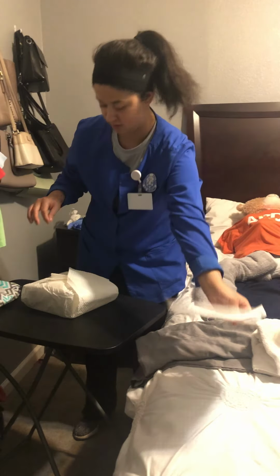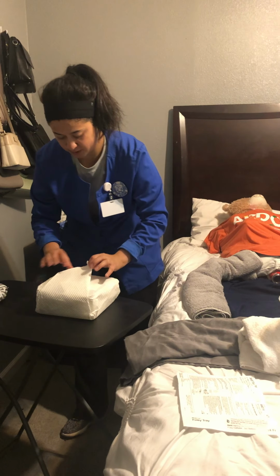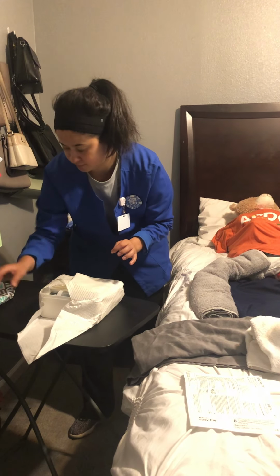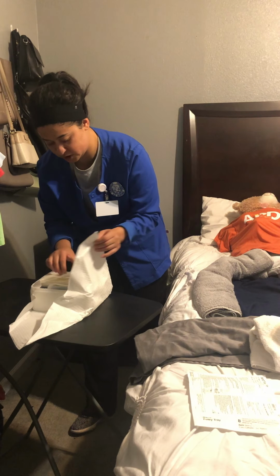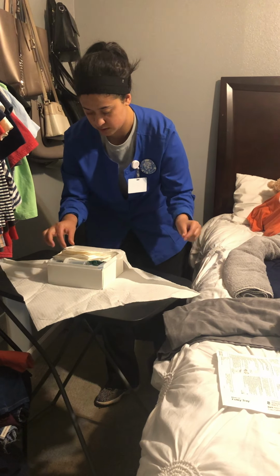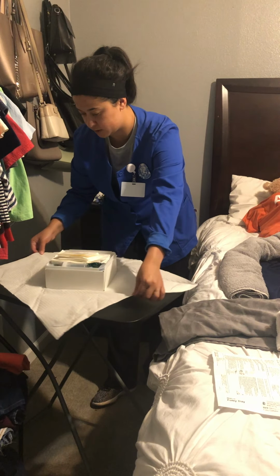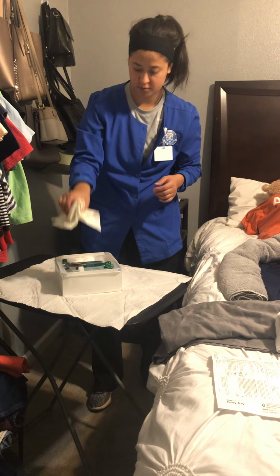I'm just going to disregard that. I want to open it away from me, so I'm going to go there. I'm only touching the 1 inch into the thing, then I'm going to turn it this way. I'm going to use the crane method and pick all this up.